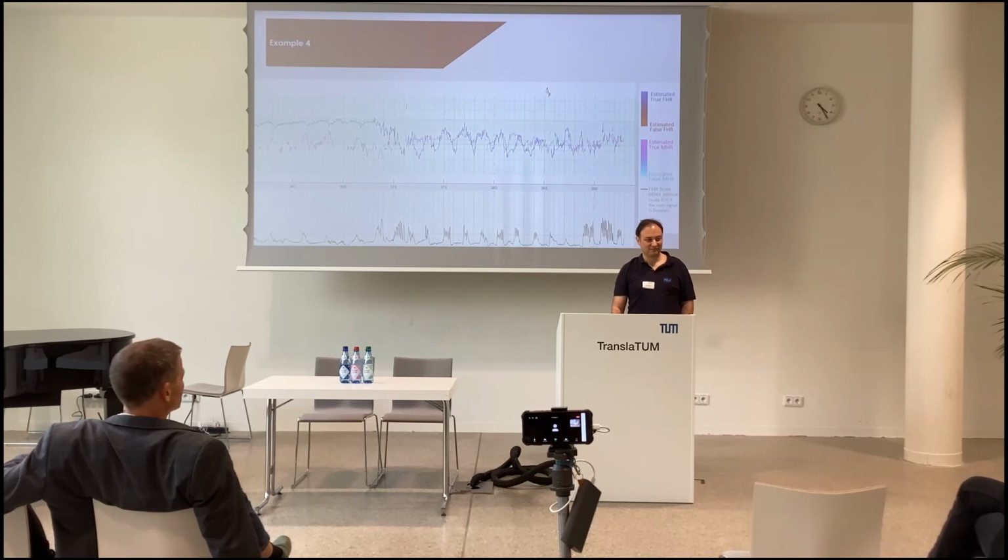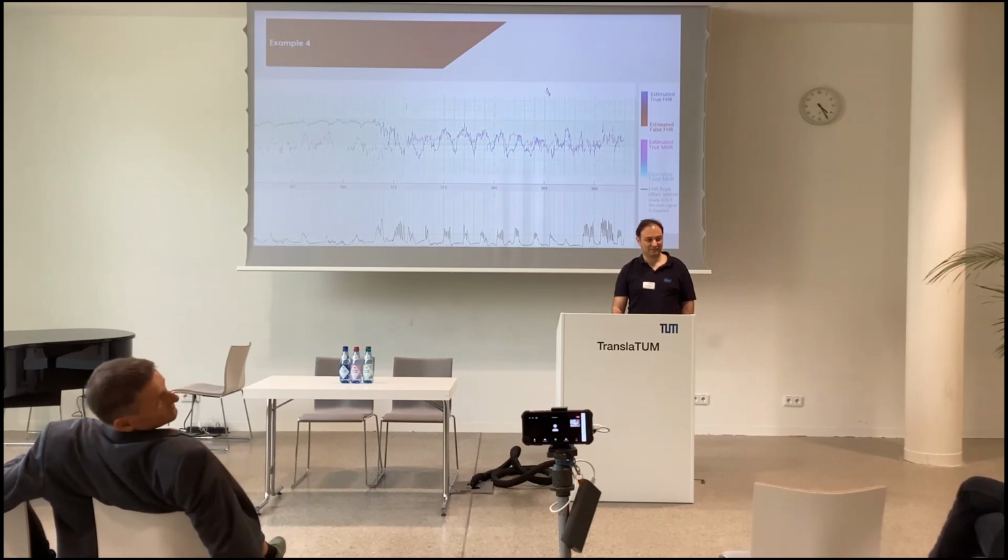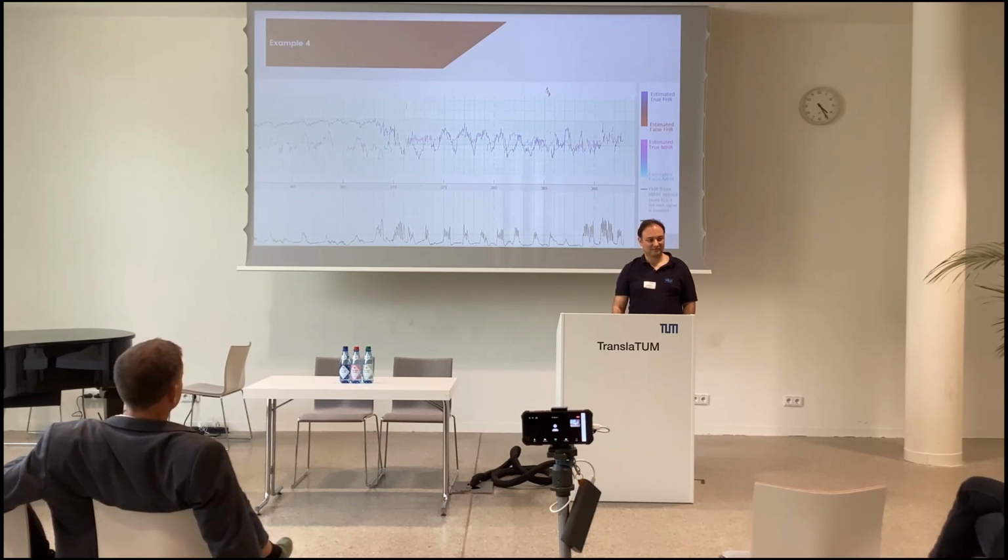It's almost like going to a cardiologist who can read an ECG or an echo. You won't go there. So personally, I just think the technology is beautiful, but do you think this is real maternal and real fetal? Because you're better than me at that. Well, on the left side of the screen, I suppose the purple color is supposed to be maternal, and the top one is meant to be fetal.